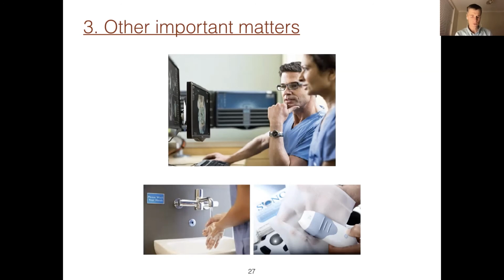One good thing I can recommend is, if your practice is not in the routine of it, limiting movement of ultrasound machines to one or two that are used specifically for mobile echoes. That's a good way of limiting the spread of disease by keeping things relatively stationary. Of course, one of the great benefits of ultrasound is that it's transportable, and I don't want to limit one of its advantages, but obviously we should do things in a sensible and intelligent way.